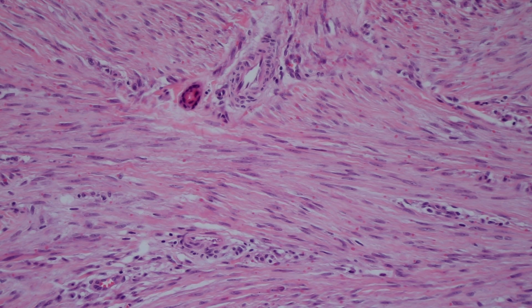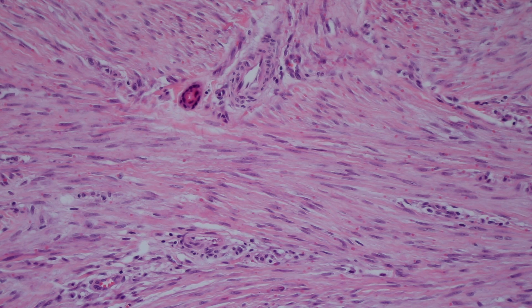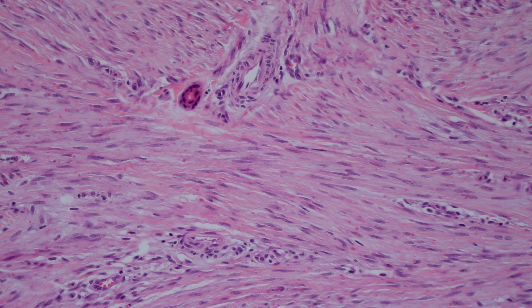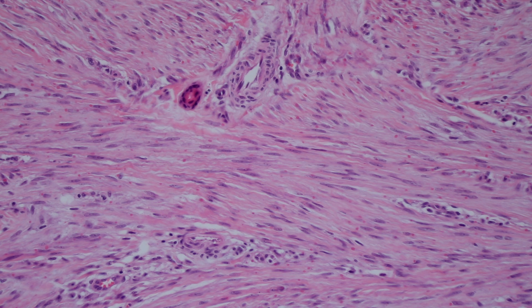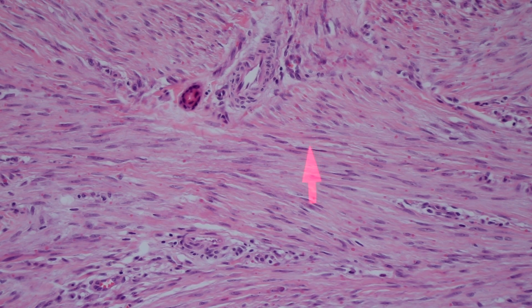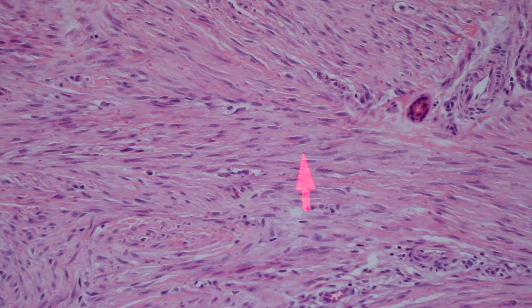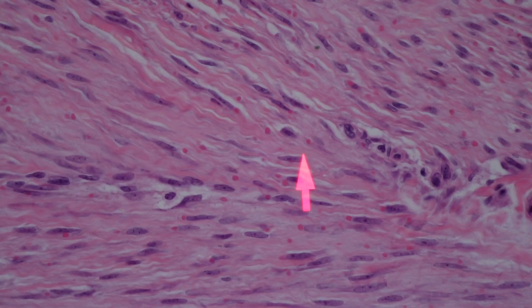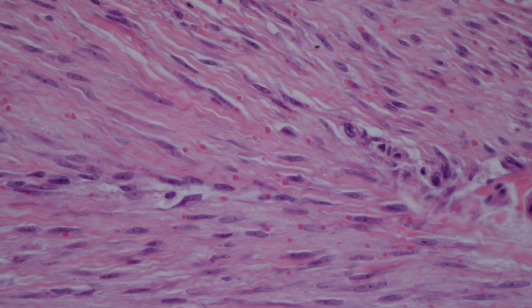You can see that these are fibroblasts. My desmoid fibromatosis video also has a discussion of how to tell fibroblasts apart from smooth muscle cells. Here's a nice example of these streaming fascicles — they're streaming like a school of fish all swimming together. All of these elongated nuclei running in the same direction, with pink collagen fibers in between each cell, which is a characteristic feature of fibroblasts. And even from here you can already see — these are the key — these are the inclusion bodies.